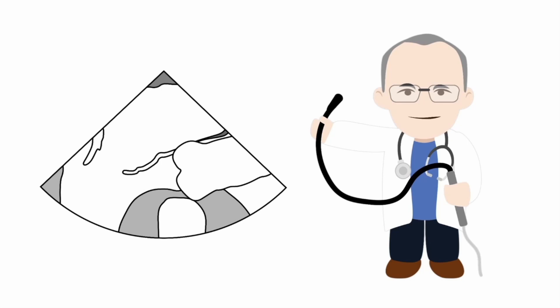In this view, we have the left atrium in the near field, the mitral valve with anterior and posterior leaflets, the left ventricle, the left ventricular outflow tract, the aortic valve and aortic root, together with a portion of the right ventricular outflow tract.